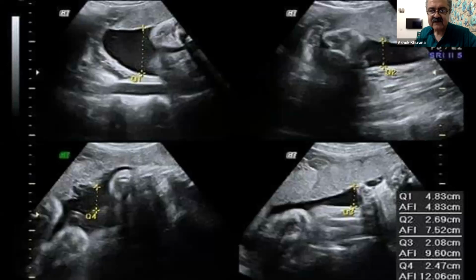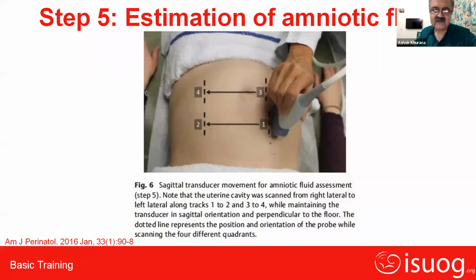If we can see the actual slide before this, where you have shown us how beautifully we divide the uterus into 4 quadrants. If you could go 1 step back, yes, in a few seconds, I think that should come on. And yes, perfect. So this is how he has shown us clearly.